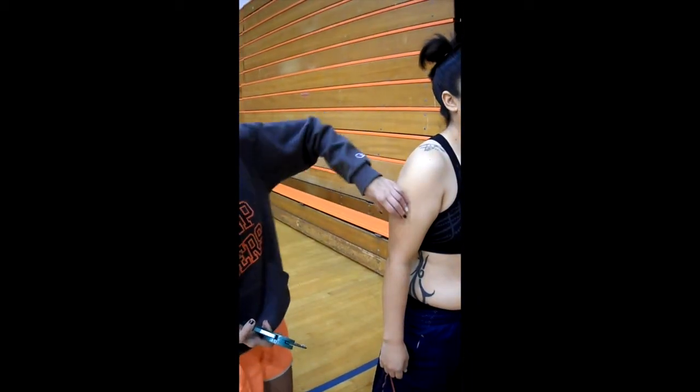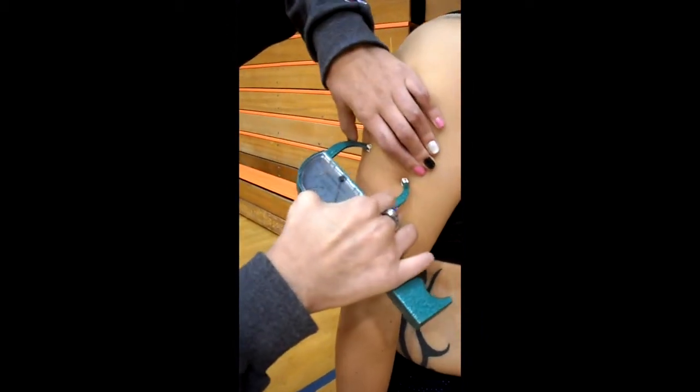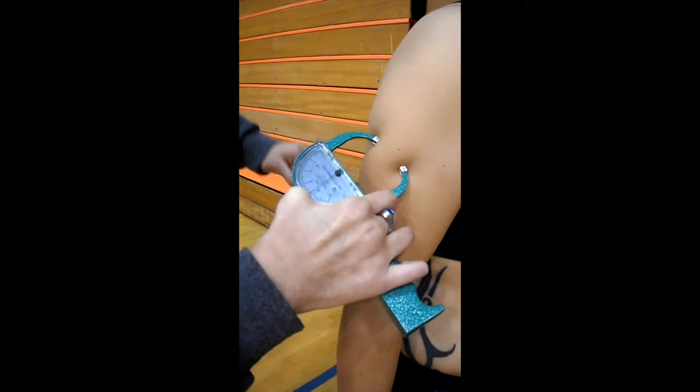The second vertical fold is the triceps. This should be taken on the posterior midline of the upper arm, halfway between the acromion and the olecranon process.